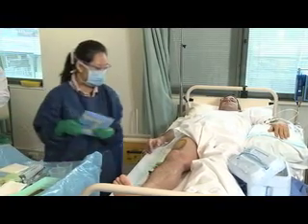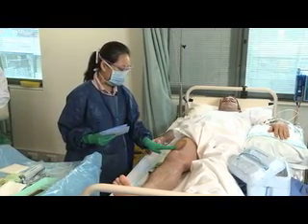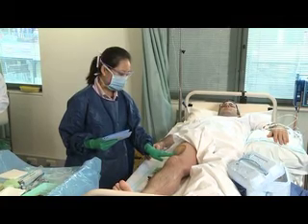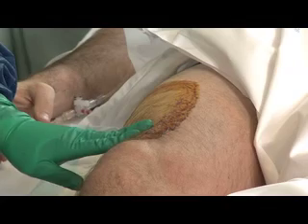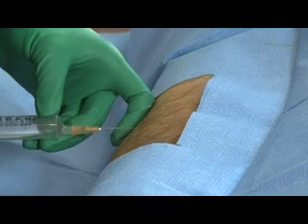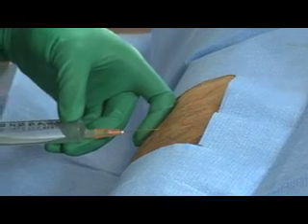Perform the biopsy at a site which is in the lower half of the vastus lateralis, on the lateral side of the body. One hand's breadth above the knee, and that will be about here. Infiltrating the area with 2% lignocaine.